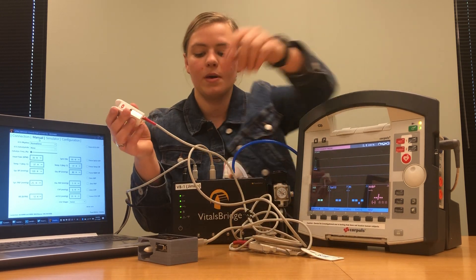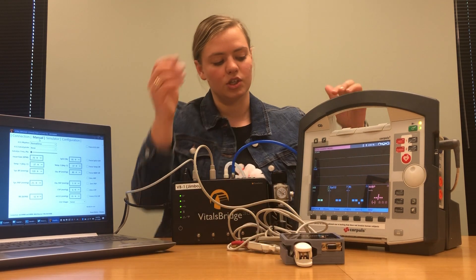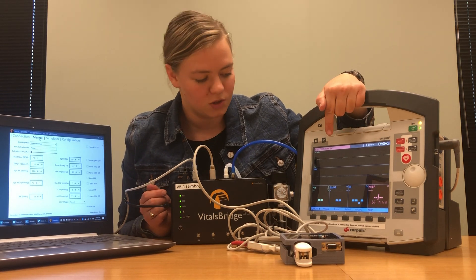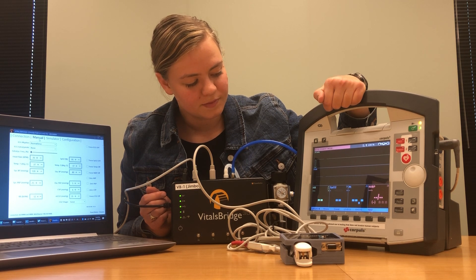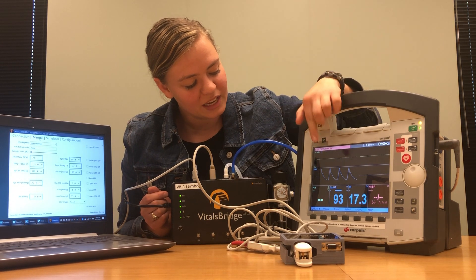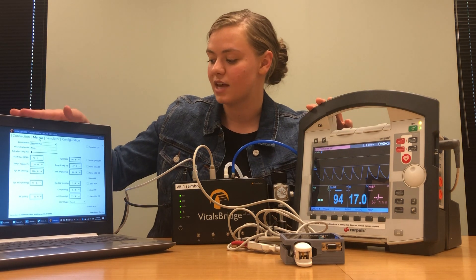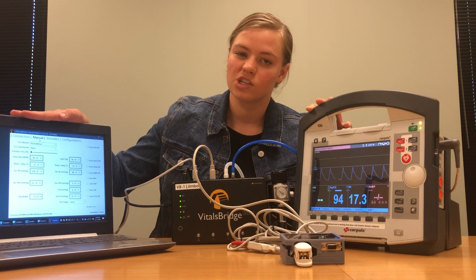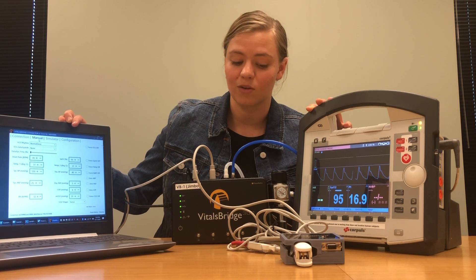After everything is plugged in, take your probe and slip it onto the adapter box right where the white finger is. It'll take just a minute, but then you should see those waveforms and the SPO2 reading. There we go — a perfect SPO2 reading and a nice waveform. If your SPO2 reading here is not matching what you have set in your VitalsBridge connector software, just like with CO2, you can perform a calibration in the configuration tab. Instructions can be found on vitalsbridge.com.